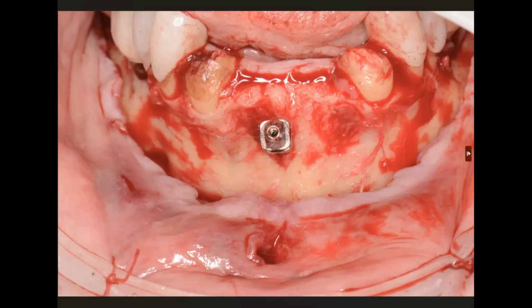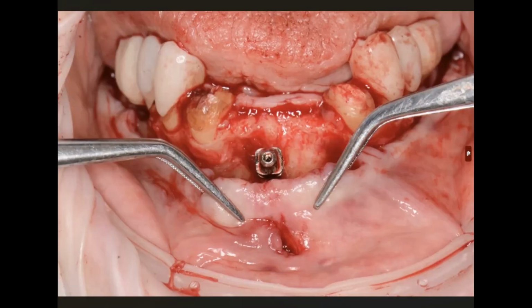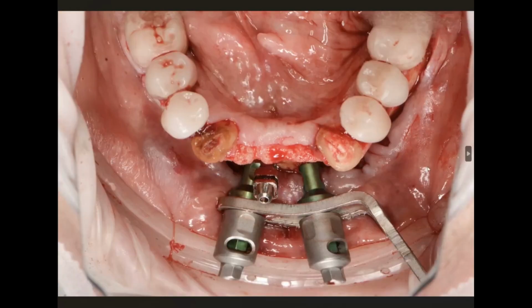Okay, so here we are. We lifted over top. All right, now I'm using XNav, by the way. I've been using XNav in my office for about a year. I've been a freehand surgeon for 23 years, but I'm not ashamed to bring in some technology where it makes everything better.